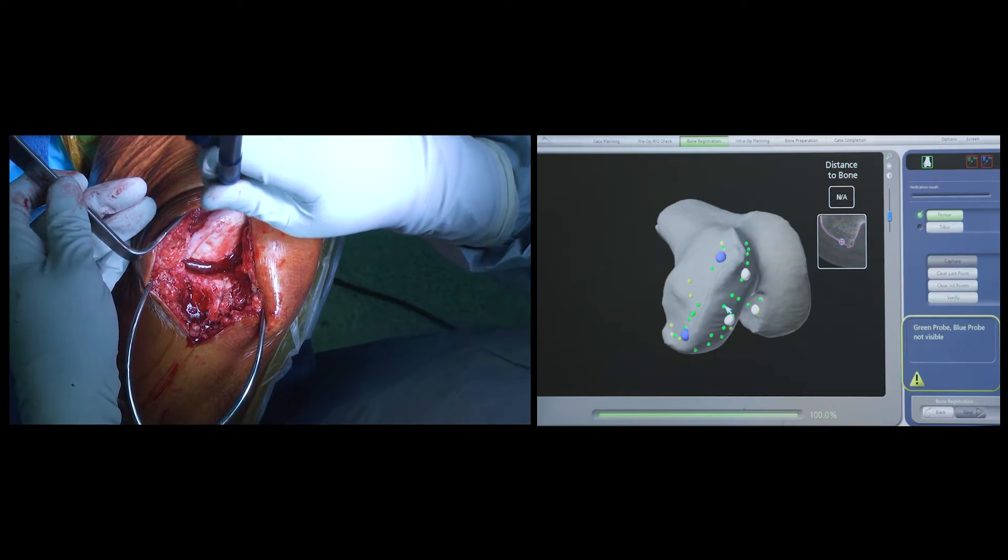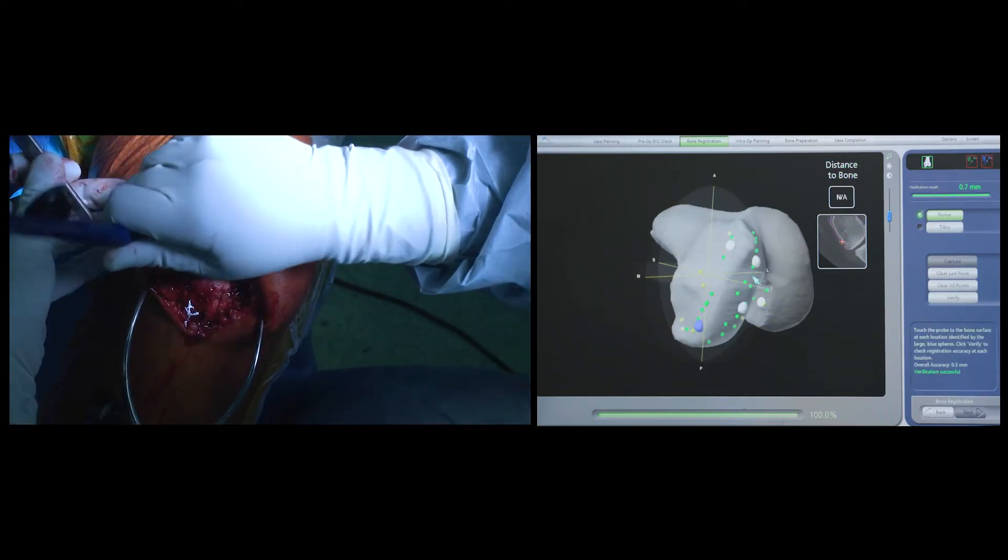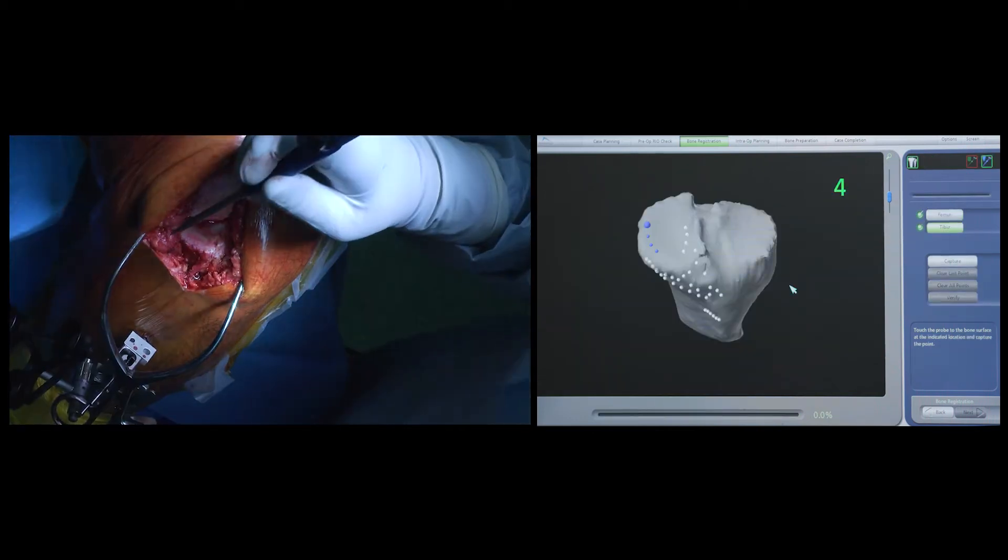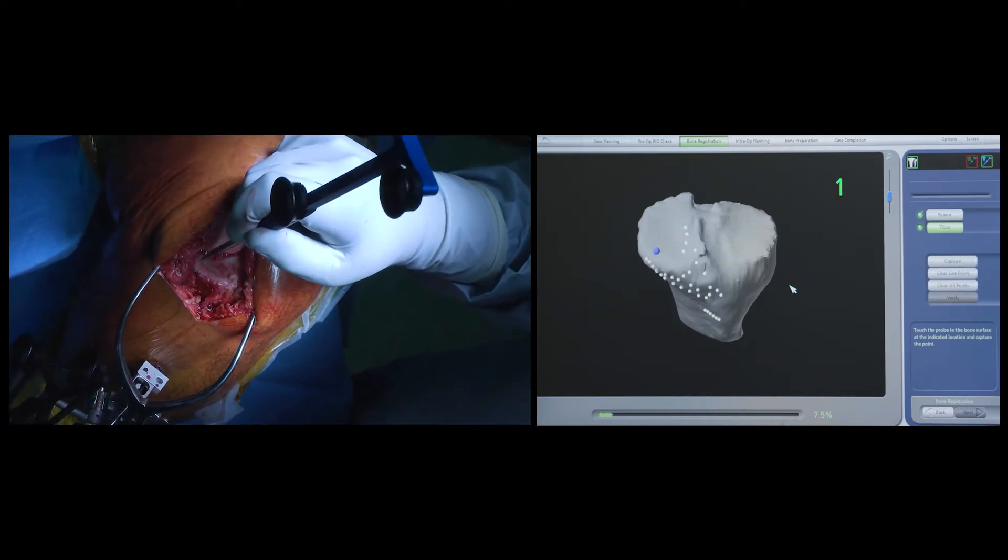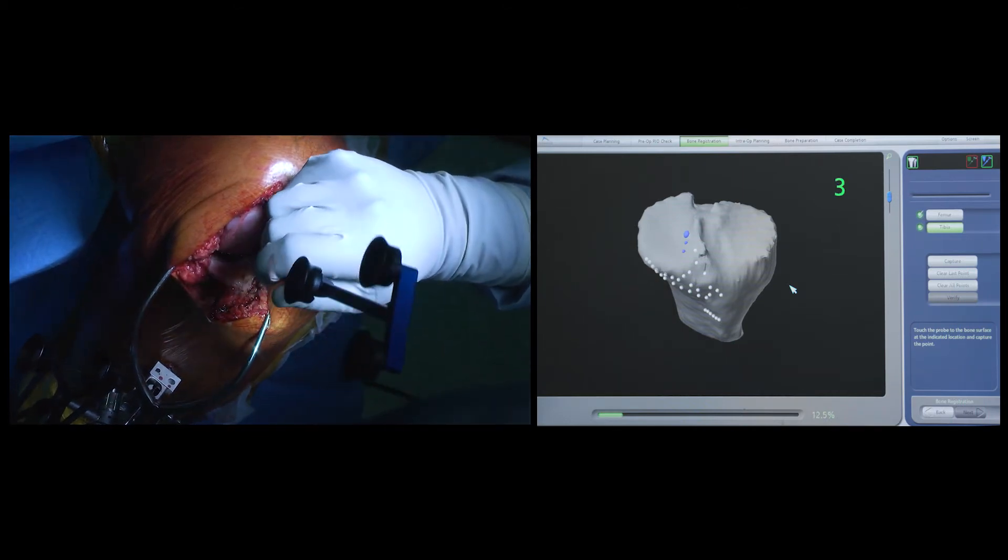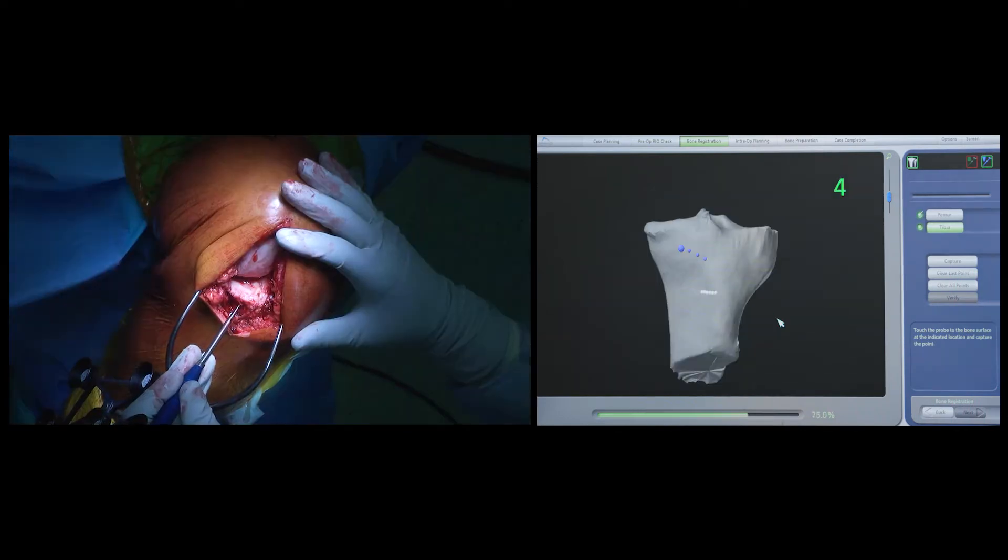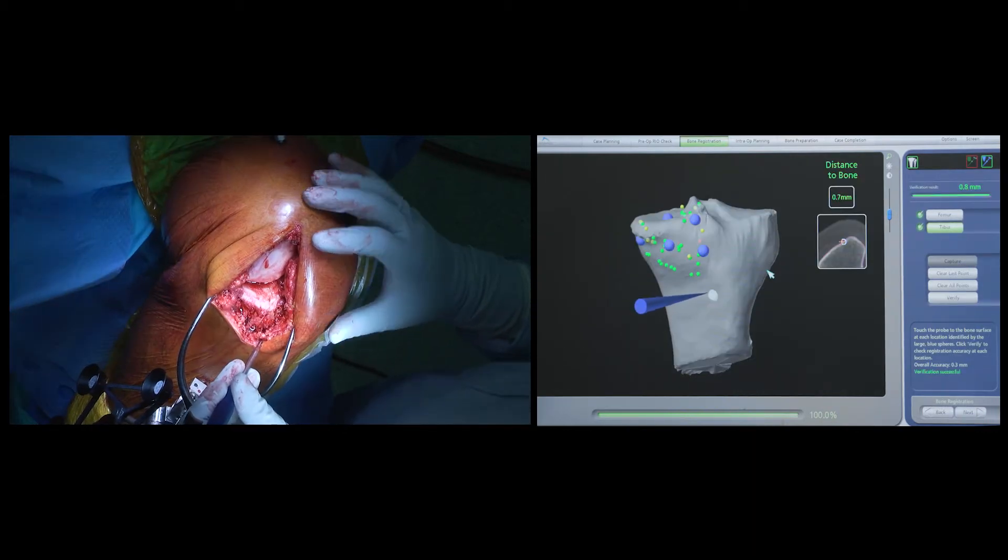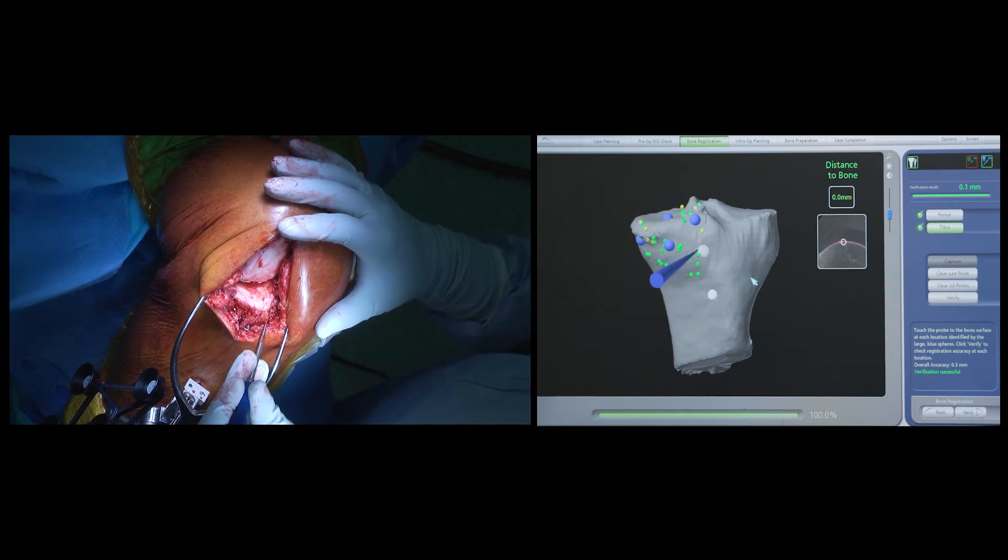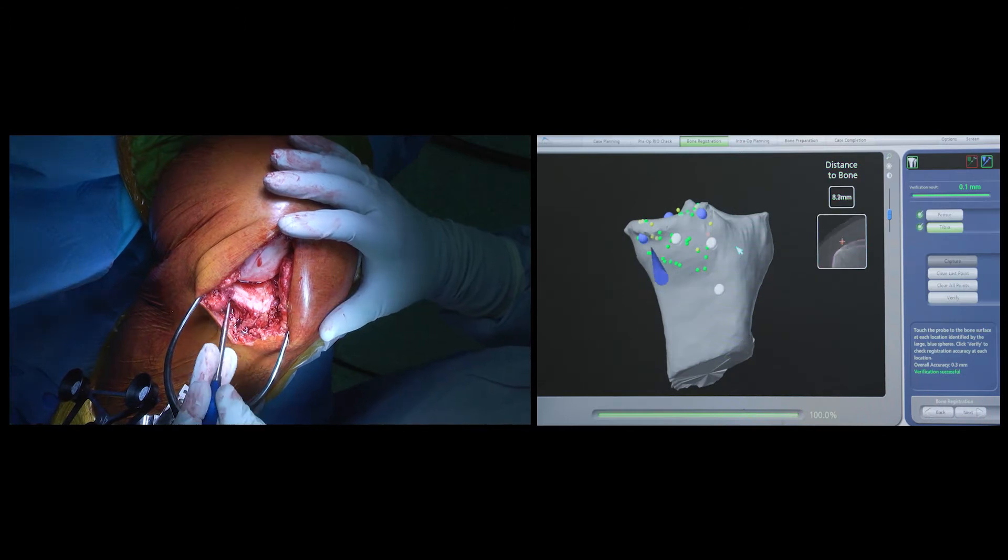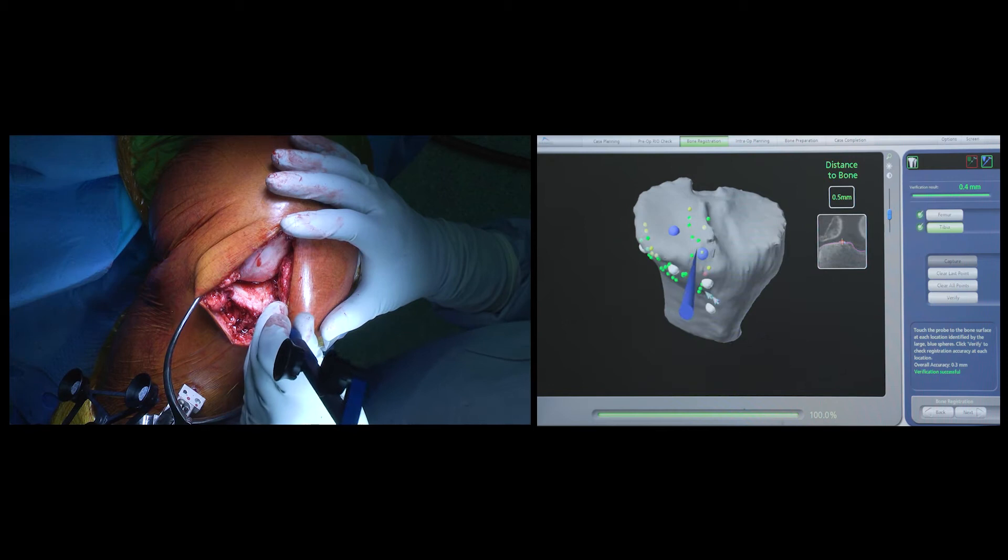The workflow will not allow the surgeon to progress unless a less than 0.4 to 0.6 mm accuracy and match is achieved between the model and the patient's anatomy. The same process is repeated on the tibial side, and once the registration process is finished, the computer then asks the surgeon to place the tip of the probe on those blue spheres as shown on the screen. This is yet another check to ensure that an accurate match has been achieved between the model and the patient's actual anatomy.